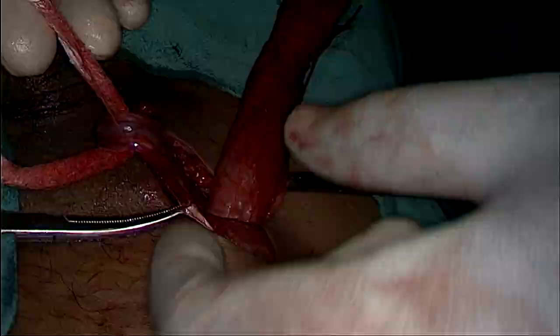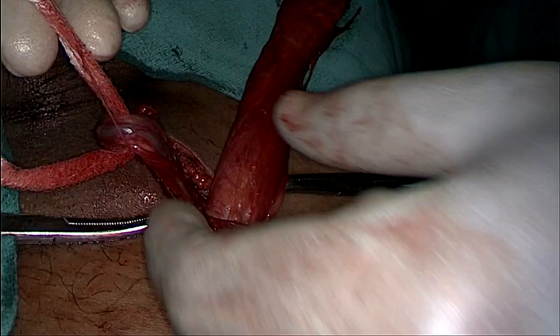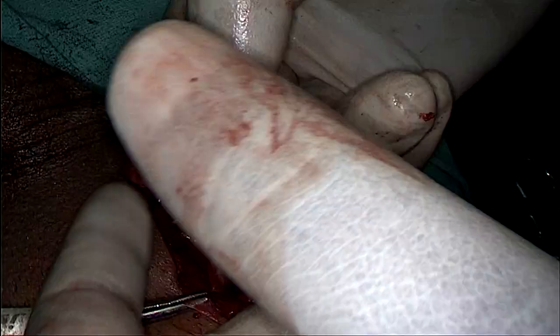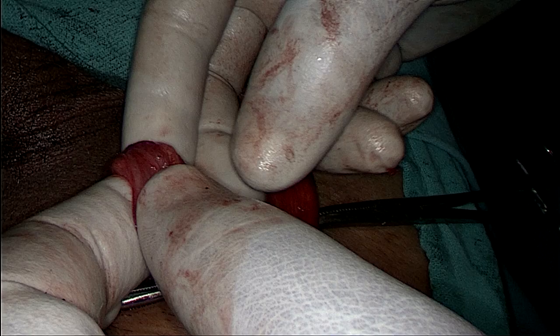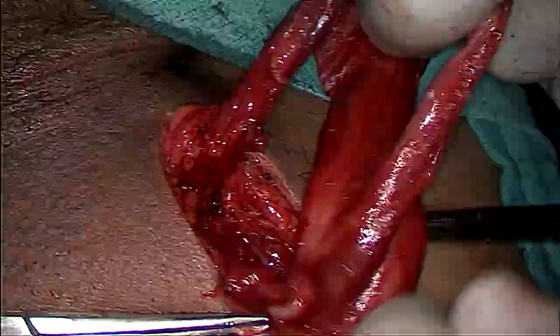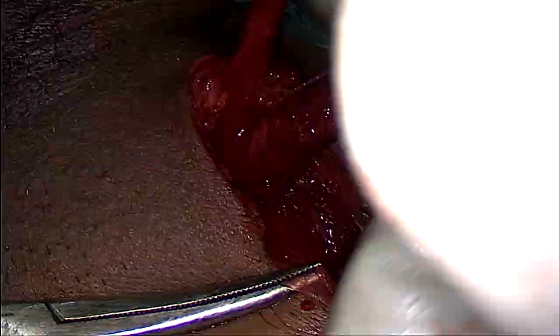As you can see, the sac is almost clear from the adhesions. There are some fine fringes that I have to remove before starting work on the sac separately. And there it is — we have separated the sac completely. Now this is the cord — the white structure you are seeing — and these are the pampiniform plexus. Hope you can appreciate it very clearly.